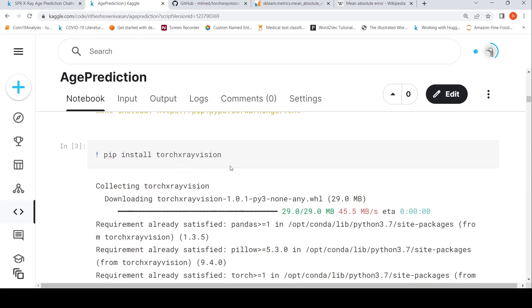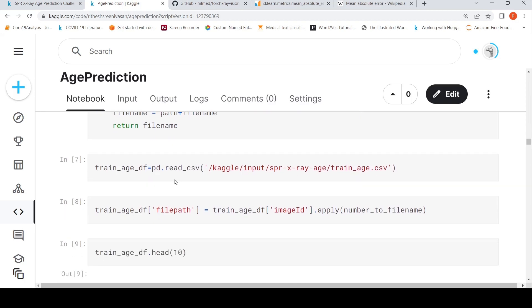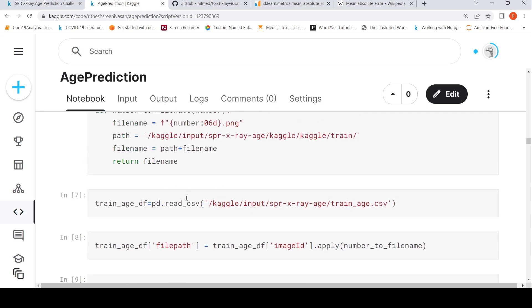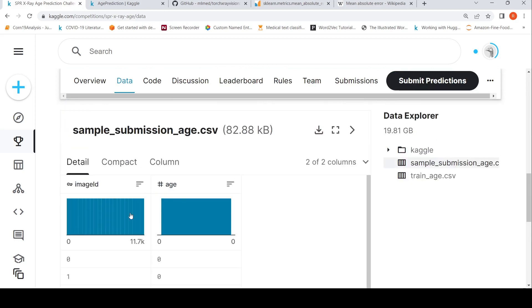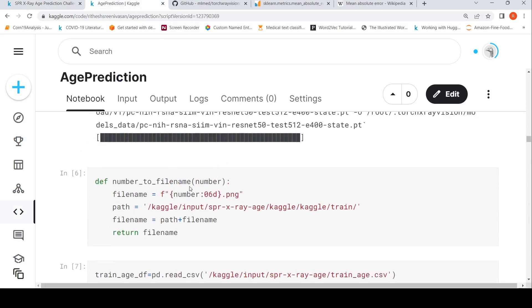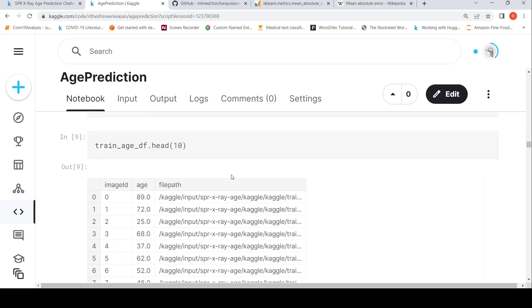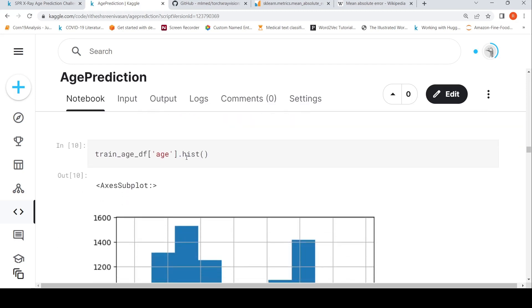After installing TorchXRayVision, I read the CSV file trainage.csv and convert the image ID to a file path, because the CSV only has an image ID while the actual images use a six-digit filename with a .png extension. After conversion, the data frame has image ID, age, and file path. The age distribution spans from 18 to 89, with some age groups like around 35 having more than 1,400 x-ray images, while older age groups like 83–89 have as few as 400 images.